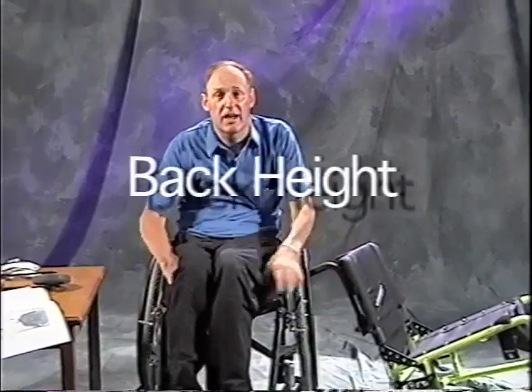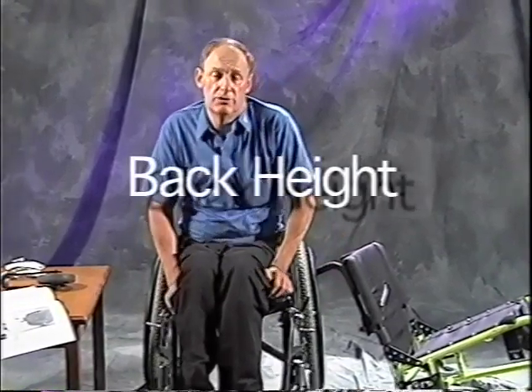The next thing that I usually look at when we're looking at chairs is the back height. A general rule of thumb is the higher injury of the quad or the person, the higher the back of the chair. And that's only roughly true, I should say, because you could have a high injury if you're trying to push.